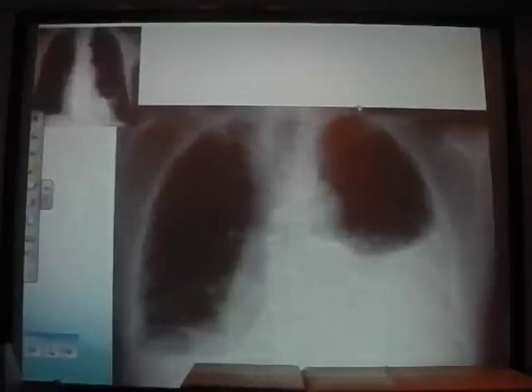Okay. We'll circle this one, but this patient has something which then led to something else. What could that possibly be? Mass. Yeah, so it could be a cancer, couldn't it? And that is a pleural effusion, because of the meniscus. If that was big enough, would it push or pull? Push.